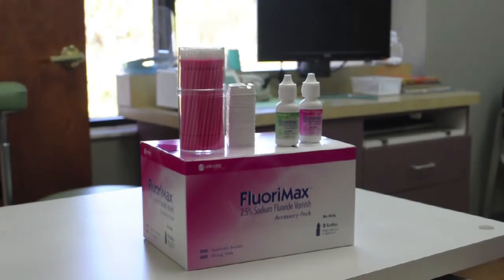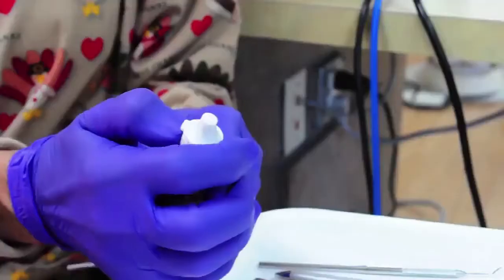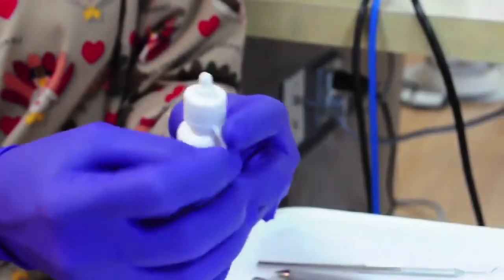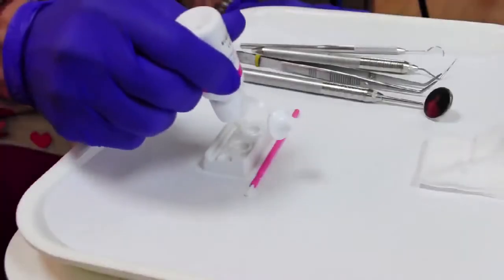Using the bottle system, simply shake prior to use. Keep the bottle clean by holding it straight up and down while dispensing. For primary dentition, use one to two drops. For mixed, two to three. And for adults, up to four drops.